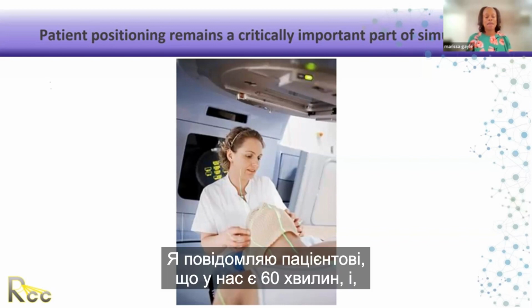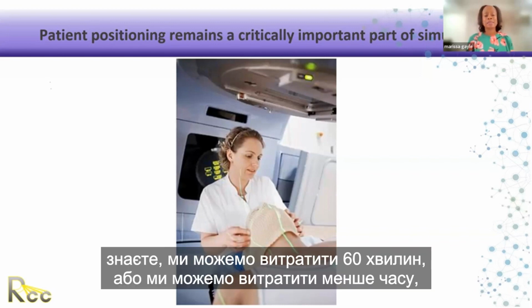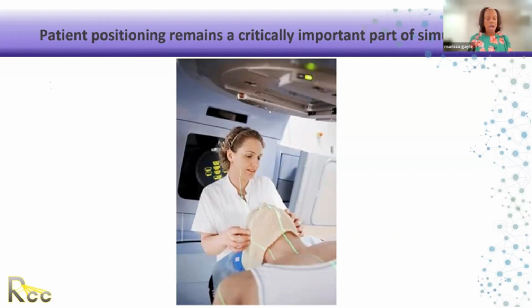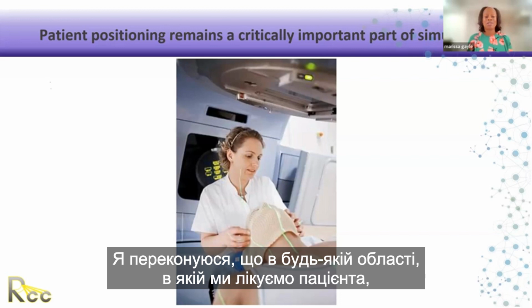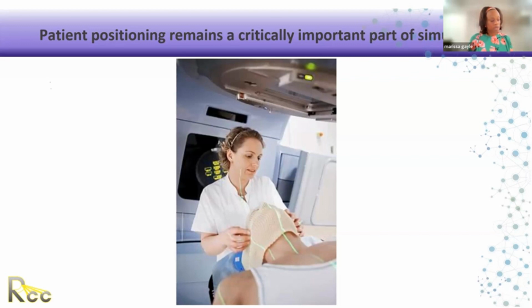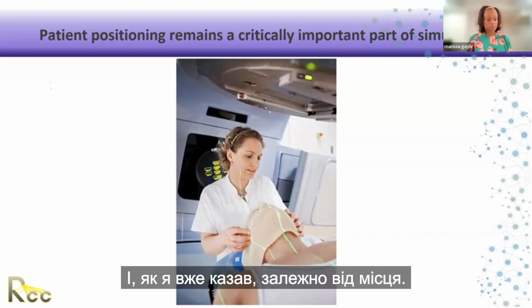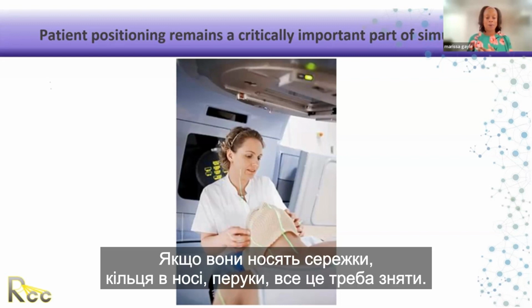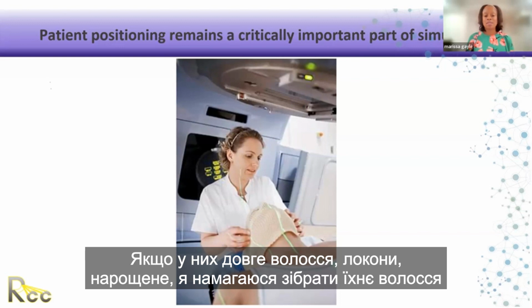I let the patient know that we're allotted 60 minutes, and we may take 60 minutes or we may take less time, but we're going to use the 60 minutes. I make sure that whatever area we're treating, the patient has changed and I have full access to it. Depending on the site, if this patient is a head and neck, I'll make sure they do not have dentures. If they're wearing earrings, nose rings, wigs, all those things must come off.